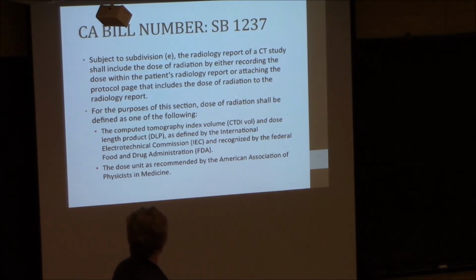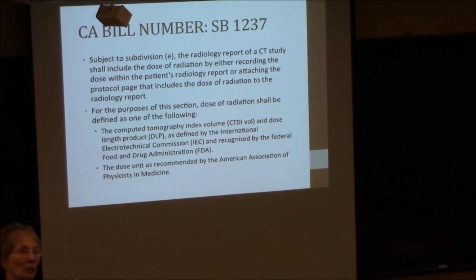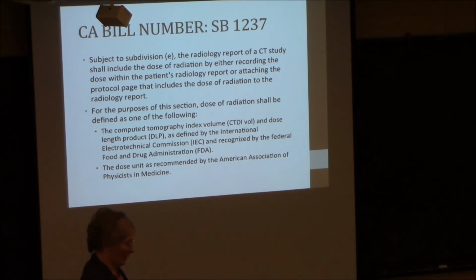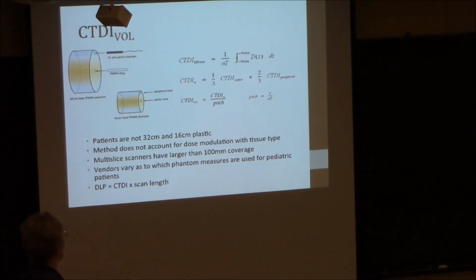And then this got pushed along by California, who passed a law that said you had to report the radiation dose in the patient medical record for every time they had a study. And that raised a whole other level of research, basically, because the question is, what do you report? Let's see, do I have time to get through all this? Well, how do we measure dose?